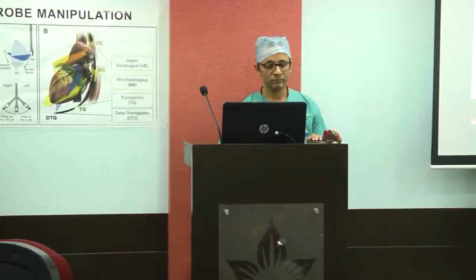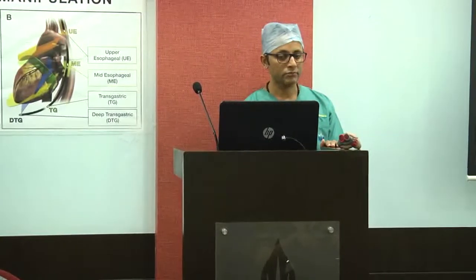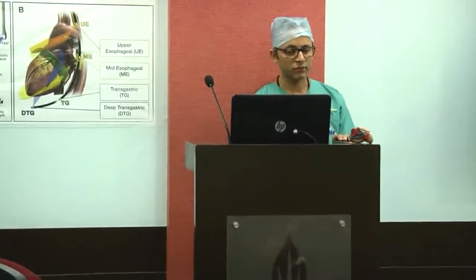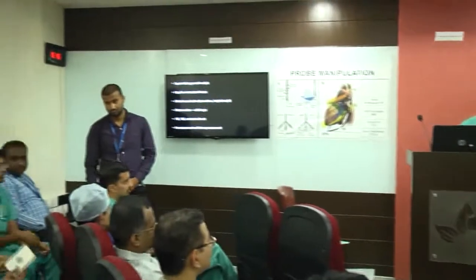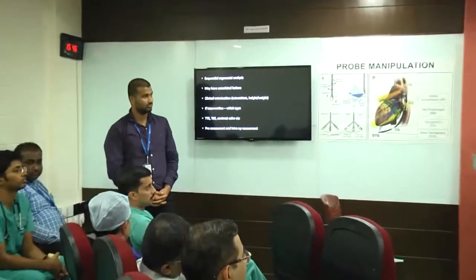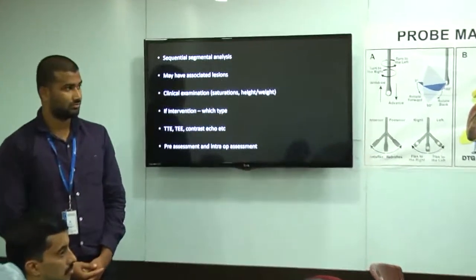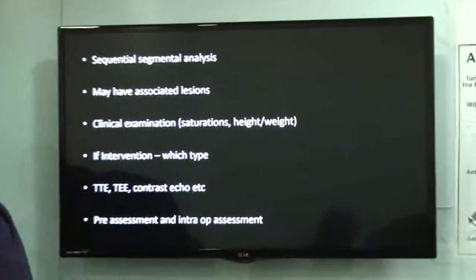So I think sequential segmental analysis, Kiran has already mentioned. And if you're doing the TE or somebody who is doing the intervention needs to know that if they have any associated lesions, do have an interrupted IVC, then there is no point in going from the femoral vein. Very important. So you need to know about the associated lesions.